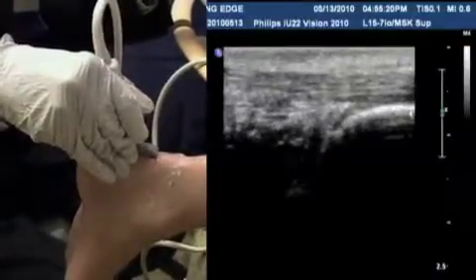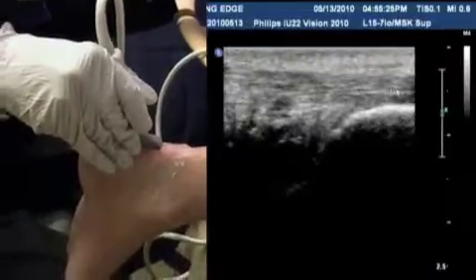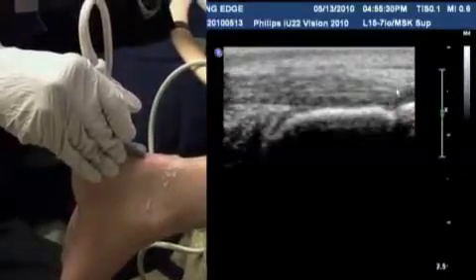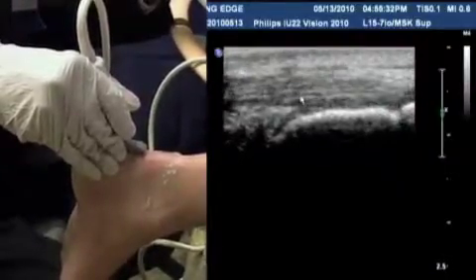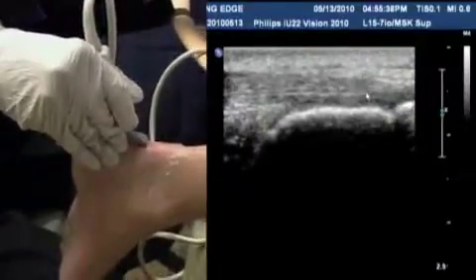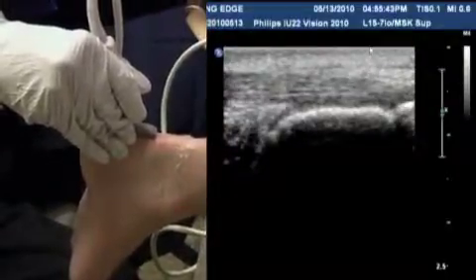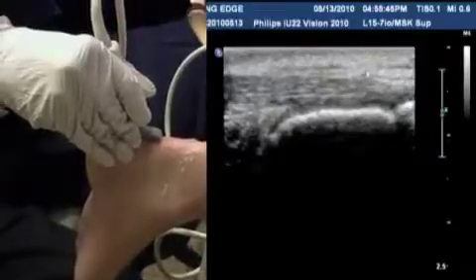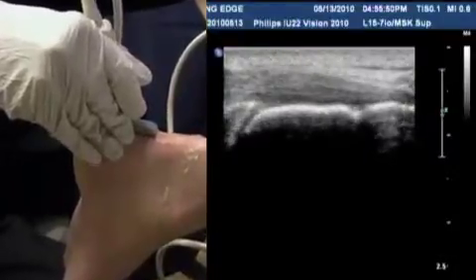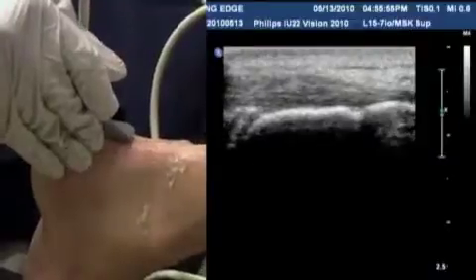The calcaneum is where the tendon insertion takes place. You can see the tendon coming down and inserting onto the calcaneum. Now when it inserts, a couple of things happen. One is the tendon gets very narrow, and the other is that at the insertion point the tendon starts to curve down. What that means is the tendon fibers are now not perpendicular to the top part of the probe, so sometimes you will get an image where the tendon starts to look dark. That's not to be confused with pathology; that's just the way the tendon appears because it's curving down.